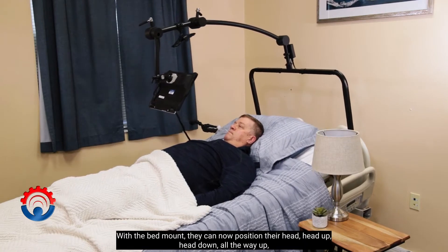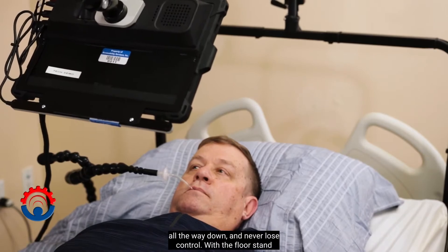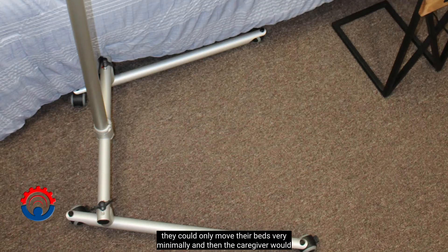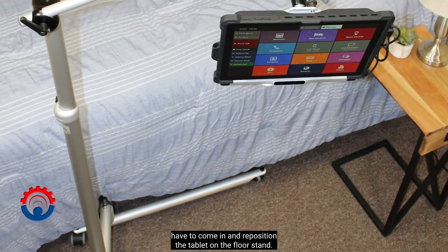With the bed mount, they can now position their head all the way up or all the way down and never lose control. With the floor stand, they could only move their beds very minimally, and then the caregiver would have to come in and reposition the tablet on the floor stand.